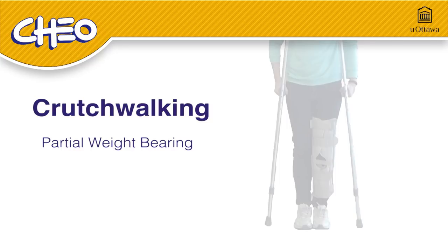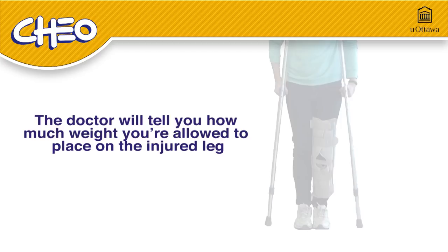Welcome to this video on crutch walking for partial weight bearing injuries. Your doctor will tell you how much weight you're allowed to place on your injured leg. This video will show you how to use crutches safely when you are allowed to put weight on your injured leg.